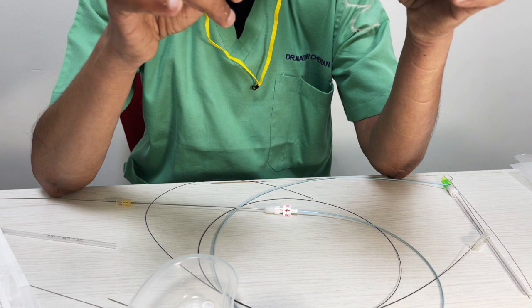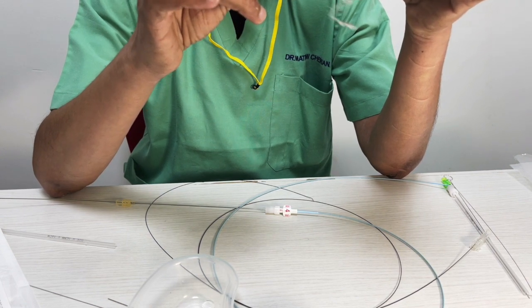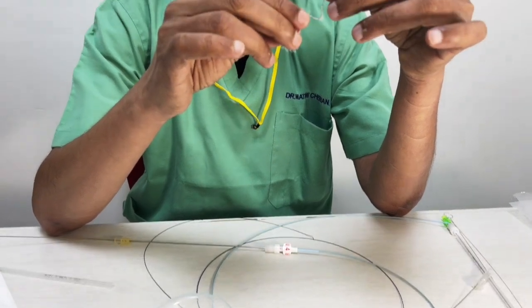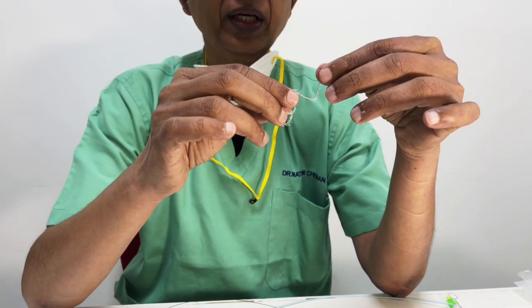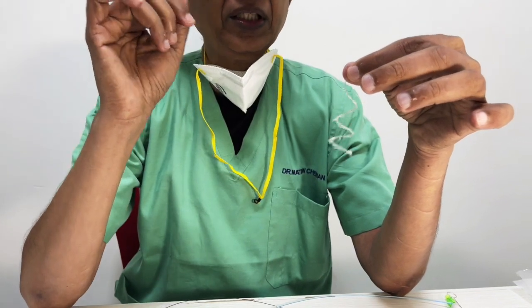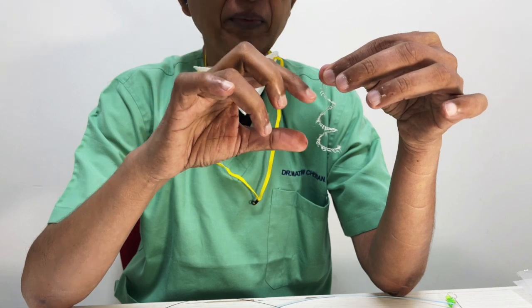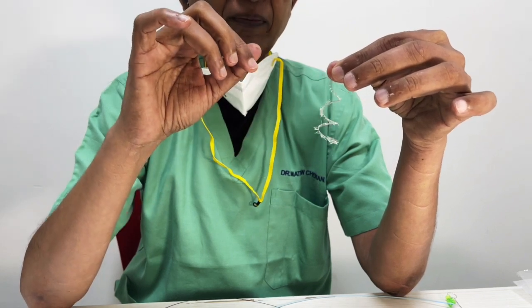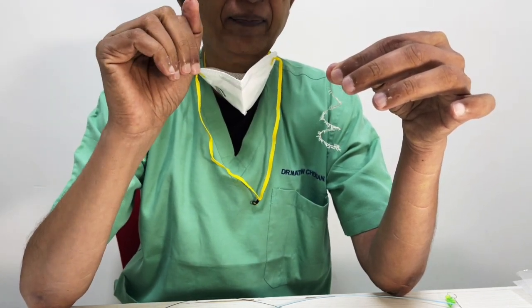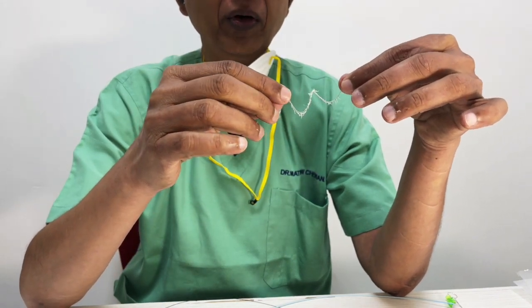Remember also, one coil will do nothing. You'll have to have several coils. And the best thing is to start downsizing coils. You put 16 coils, then you put 14, 10 so that you get a tight knot at that point, right? Now, these coils, like I said, will come in diameters down to even 3 and 4 millimeters and lengths between 7, 14, and even smaller. So you choose it depending on the anatomy that you want and the amount of space that is available for you.